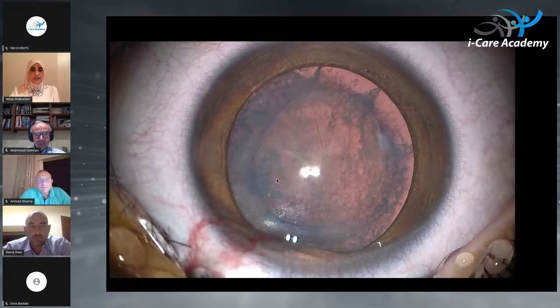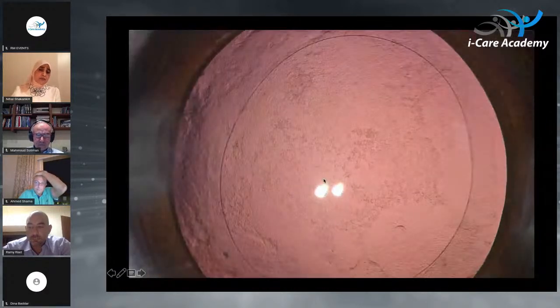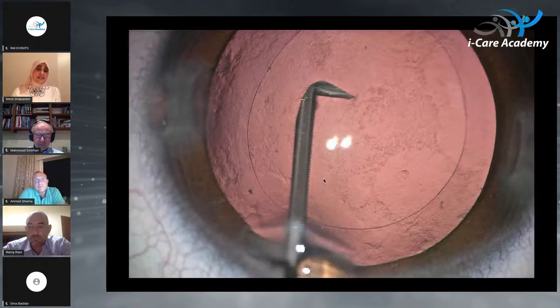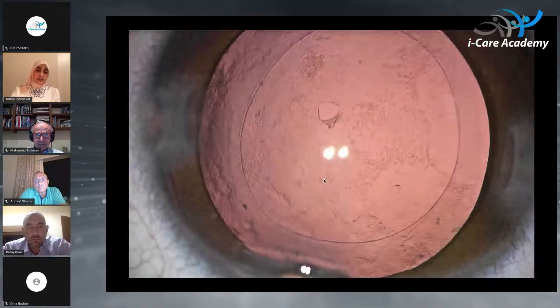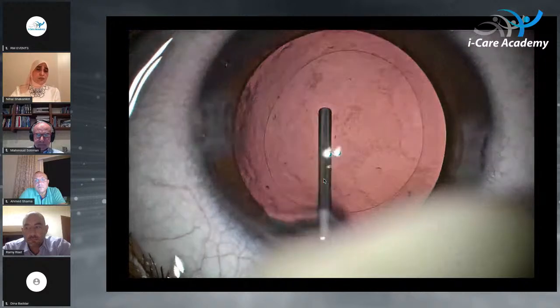This is the anterior rexis, and after irrigation aspiration, I see many cases like that with fibrosis of the posterior capsule, here with magnification. But the posterior capsule in these cases is soft. You can make the posterior rexis in the conventional way by hooking of the posterior capsule, tenting, and then tearing into a triangular tear, and then injection of viscoelastic into the Berger space.